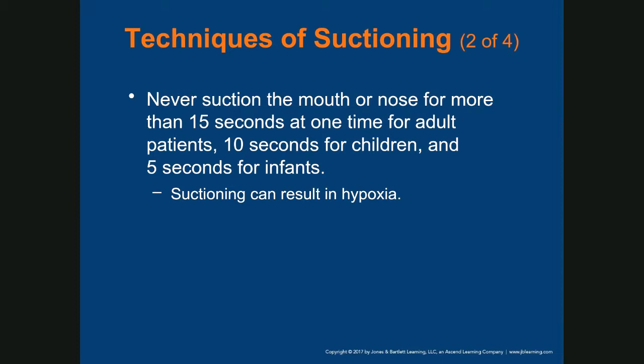If you suction the patient too long, you can cause hypoxia. And you can dry out the mucous membranes. And you can also stimulate the vagus nerve, which controls the heart rate, and that can slow down the patient's heart.